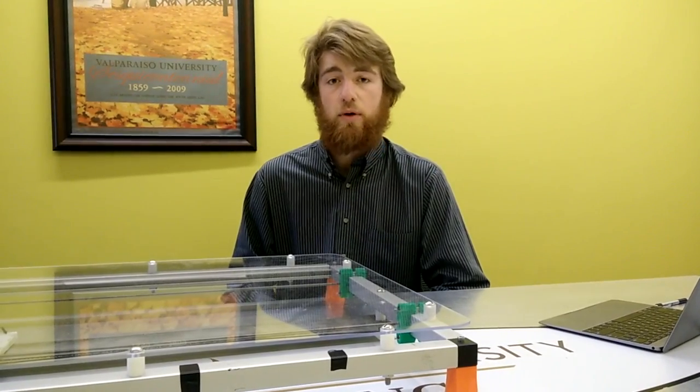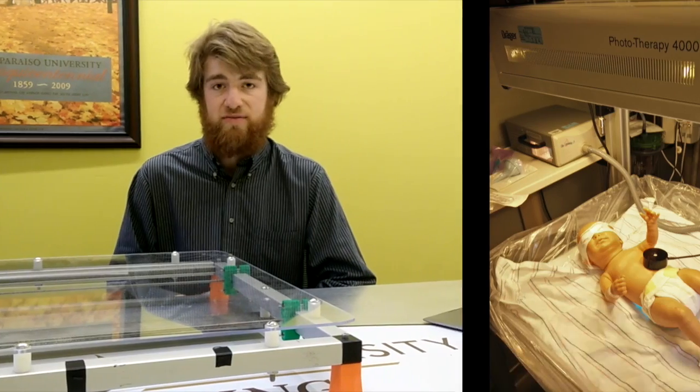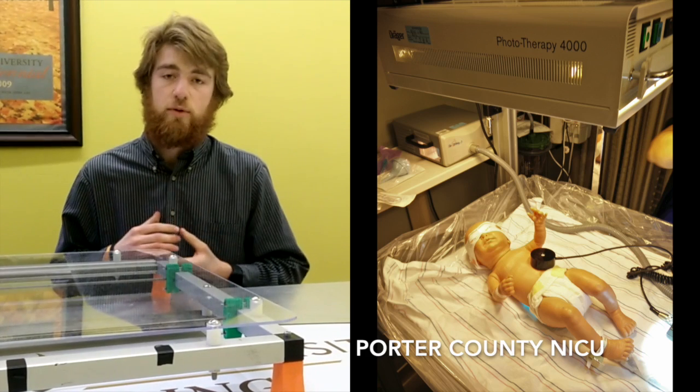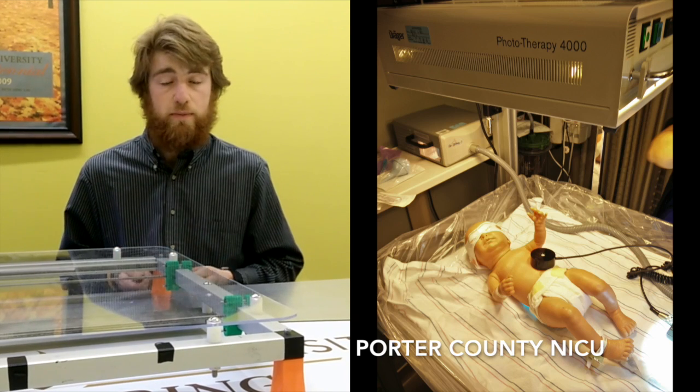In order to aid this process, doctors can apply 400 to 500 nanometer light to an infant in order to speed up the process through the absorption of light into the skin and bloodstream, which then transforms the bilirubin particles into something that's more easily excretable.